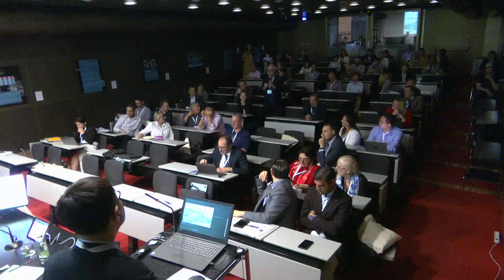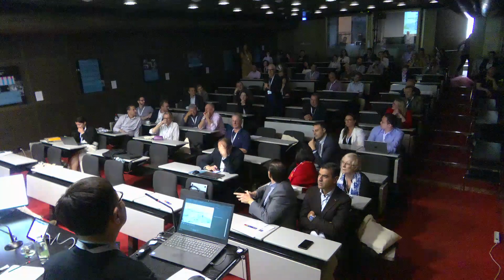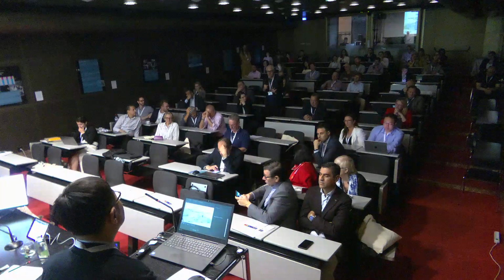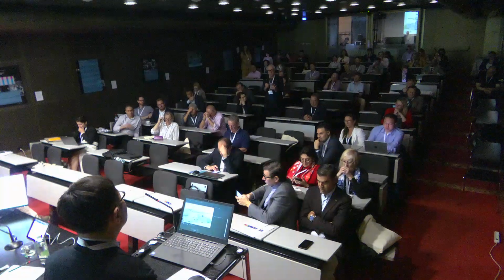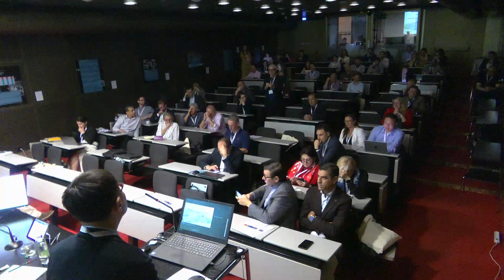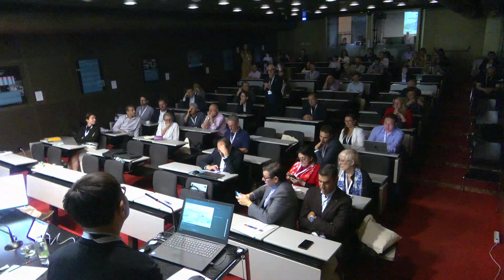I think I understand your enthusiasm, but I think that needs to be tempered by the fact that, as far as I understood correctly, you don't have healthy volunteers. Healthy volunteers are even more relevant for artificial intelligence interpretation than for human interpretation. So this is a missing point. And what I want to know is if you have any comparison for the symptoms in people that have normal balloon expulsion test or delayed balloon expulsion test, and if there is any relationship with your finding with artificial intelligence.